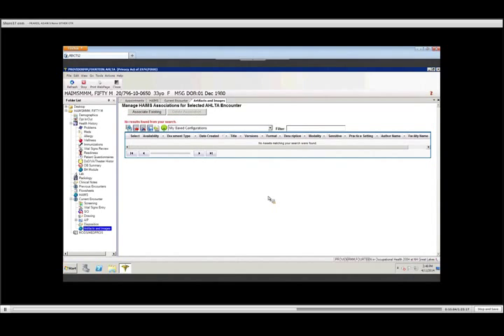And the HIPAA auditor has the ability to run a report to see exactly what's been done by either the patient's name or by the user. So yes, if that did happen and you paperclipped it and I turned around and unpaperclipped it 2 days later, there is a report that can be run that would say that you paperclipped it and I removed it. So yes, it can. You can find that information out.